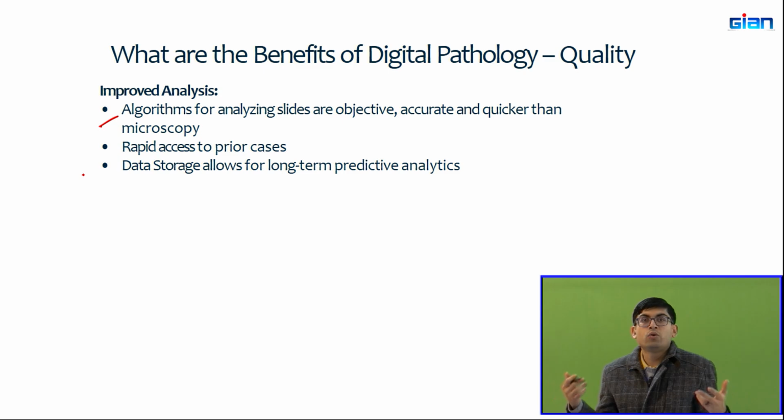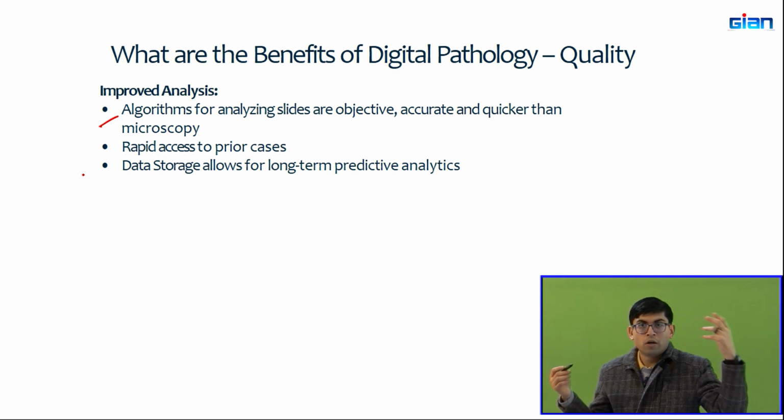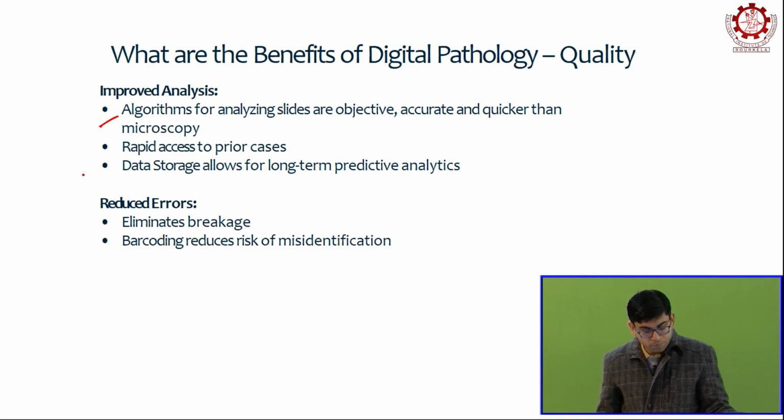So let's say the pathologist wants to teach their residents or their fellows, their medical students. There are some interesting cases that they have observed 5 years ago, 10 years ago. They can keep a note of that on their server, and they can immediately pull that slide, as opposed to having it physically, where they have to store it somewhere, right? So that's how it becomes important, and the quality is also enhanced.